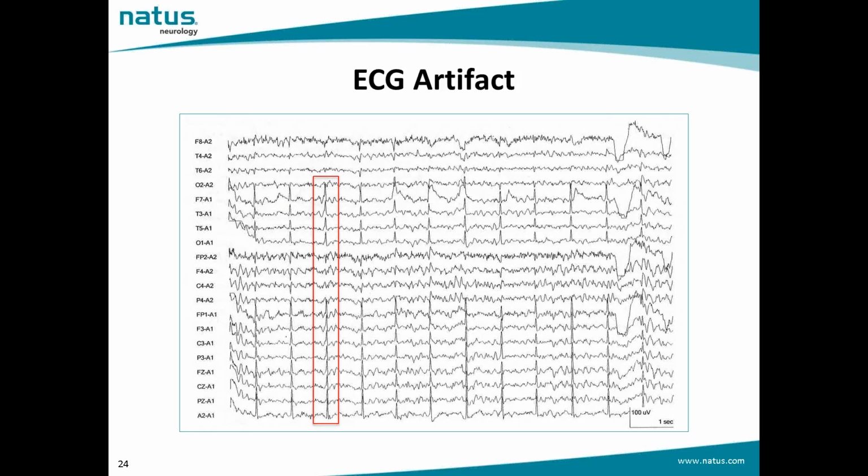These peaks correspond to the QRS complex, as shown in the picture here, and they are recorded from the temporal region, mainly from the left side, and by using a transversal montage with wide interelectrode distances. The peak frequency is constant in the same patient, and the ECG artifact may change amplitude throughout the respiratory cycle.